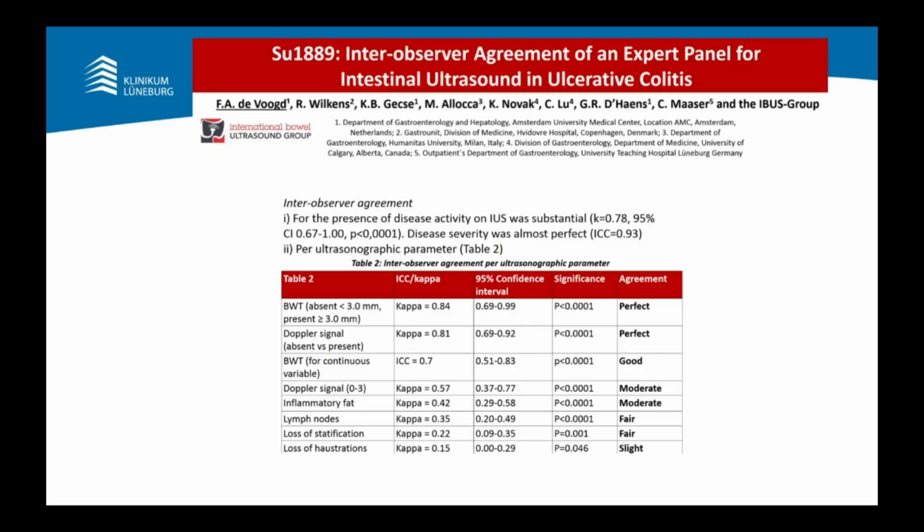Now the question is, how good are we actually with the interobserver agreement of our parameters? In a multicentric cross-sectional prospective study, 5 gastroenterologists with high expertise in intestinal ultrasound were blinded to the clinical status of the patient and blinded to the outcomes of the other readers. All received the same number of video loops of prospectively collected data from patients with ulcerative colitis, performed, as you can see, by various investigators from various countries from the International Bowel Ultrasound Group.